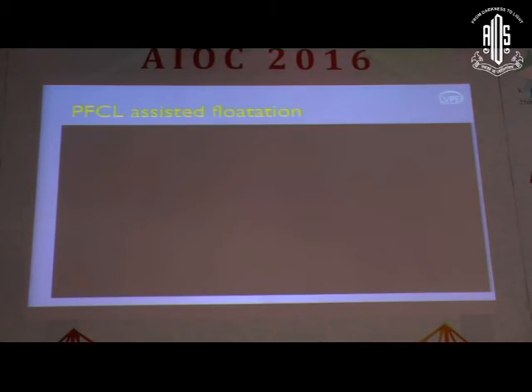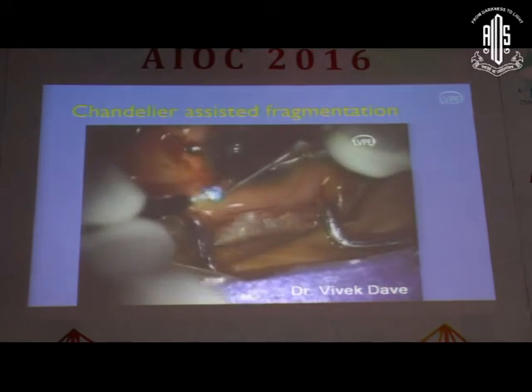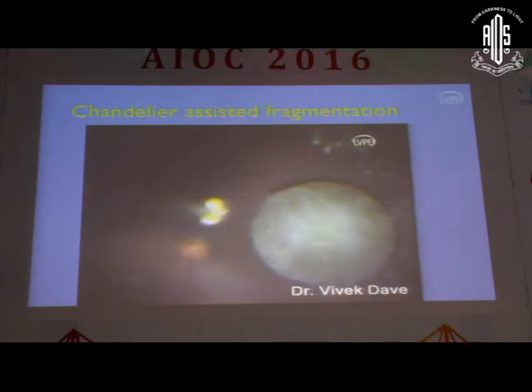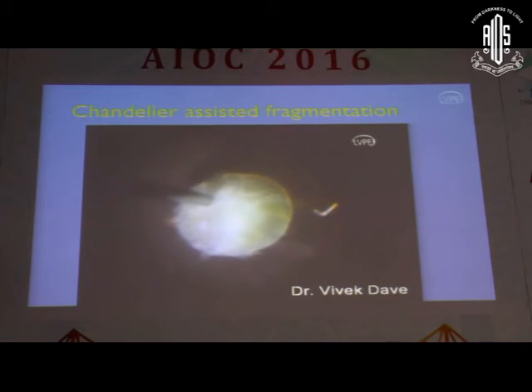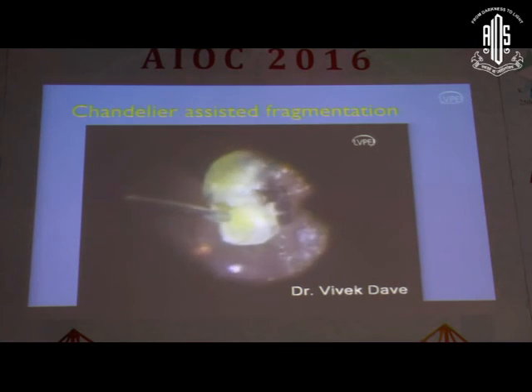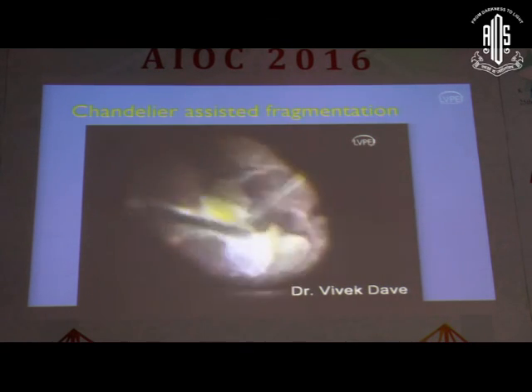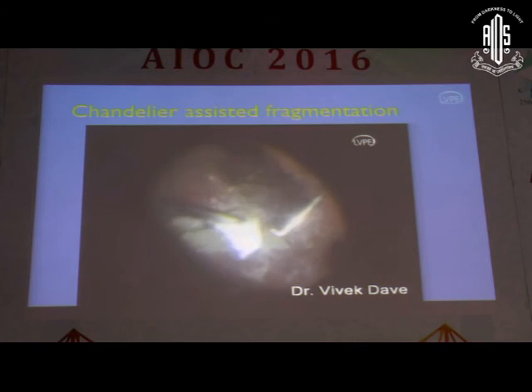Now this is something which I've been doing very frequently. Put a chandelier illumination. Once you do that, it removes the necessity for the endoilluminator. And instead of the endoilluminator, from the other end I insert a chopper. Now you elevate the nucleus, bring it to the mid-vitreous cavity, and because you have a chopper, you get a greater purchase on the pieces, and you can break the pieces in the vitreous cavity very easily. So this is like doing a cataract surgery, but not having a posterior capsule behind, so you're not really worried that much. With a little bit of practice, it's very easy, very quick.